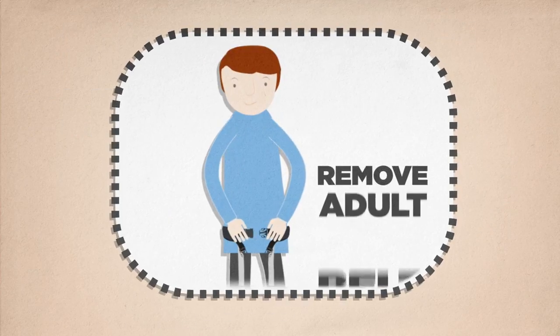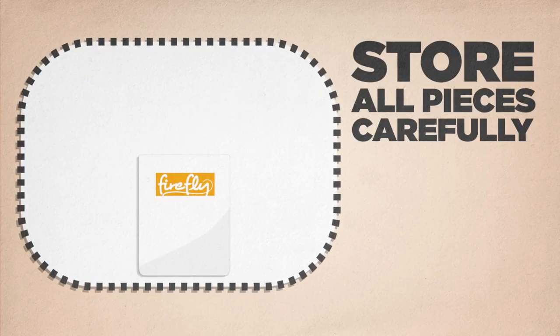Remove your adult belt. Store all pieces carefully for your next adventure.